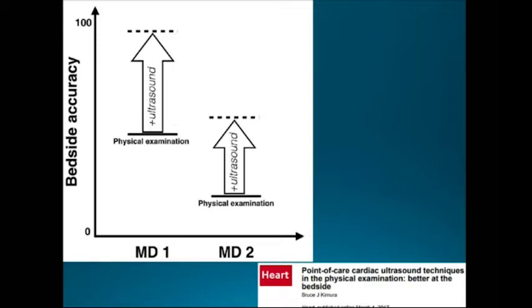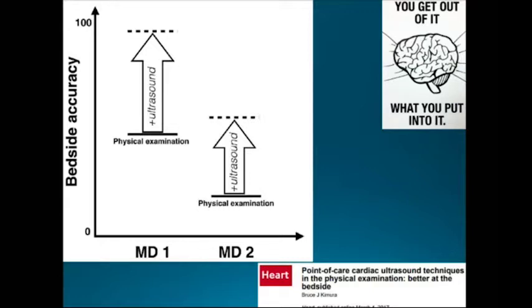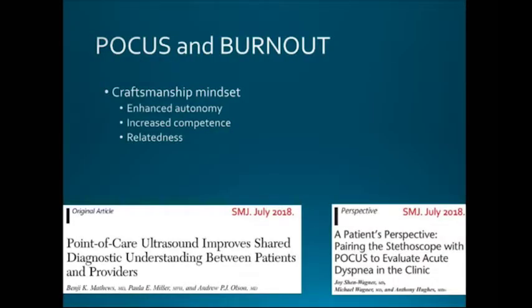But just because they can't obtain 100% sensitivity and 100% specificity doesn't mean they shouldn't be able to use point-of-care ultrasound. Because what are we comparing it to? We shouldn't be comparing it to the formal consultative imaging studies. We should be comparing it to what they can do at the bedside with their otherwise non-enhanced skills. It does require practice, a lot of thought and deliberation, and depending on the applications, sometimes it's challenging. But that being said, I like the challenge. I like the idea that my physical exam is a craft.